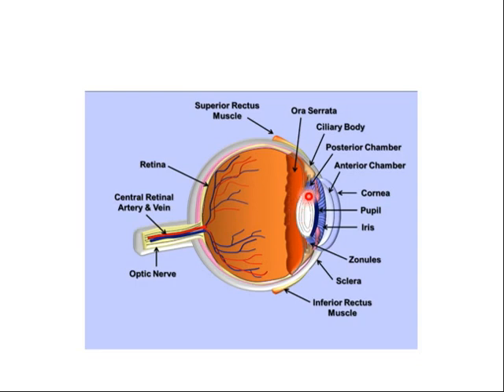This lentiform shape is the lens, which has an anterior and posterior capsule. Posterior to the posterior chamber and posterior to the lens, we have the posterior segment. In the posterior segment, we have the vitreous. This contains jelly material, the vitreous, and this holds the retina in place, applying pressure on the retina and holding it in place, and doesn't allow any detachment.